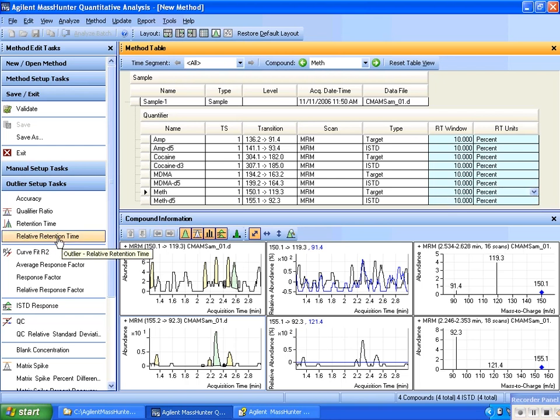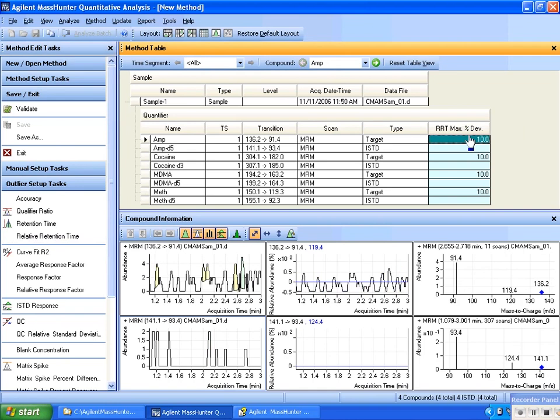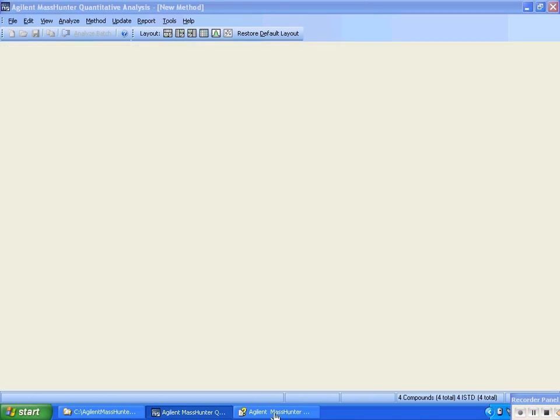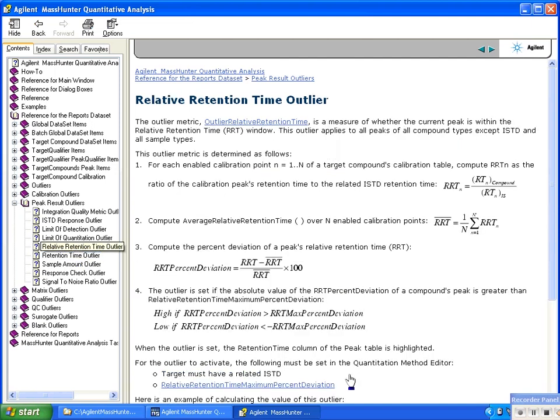Also, I have the capability of doing relative retention time, which is, again, a percent argument, percent deviation of the relative retention time max. Let me stick with the retention time, and I'll go back to the sample. While that's happening, let me discuss the calculations involved in making retention time outliers. If I look at the help, I'll see that there are equations that describe the retention time outliers as well as all of the other outliers. For example, the relative retention time calculations are shown here. So I should be able to figure out how those calculations are being made from the documentation.